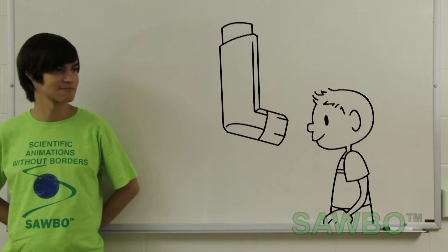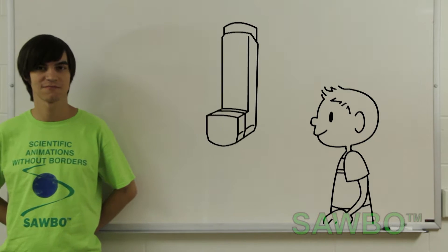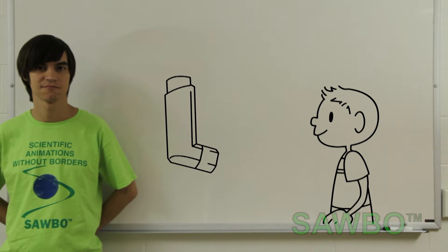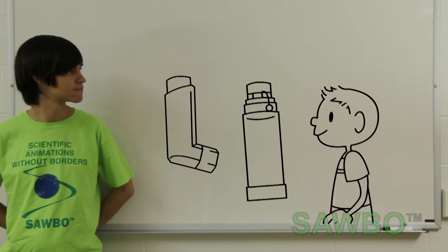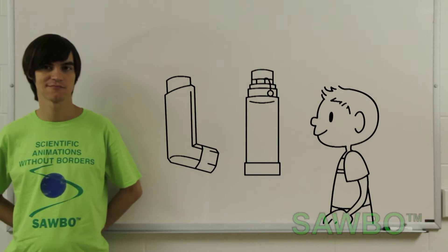This is a basic metered dose inhaler. Your inhaler may look slightly different in color, size, and shape, but it will still work the same. This is a spacer. Normally, kids and those who need a slow delivery of medication need to use a spacer with the inhaler.